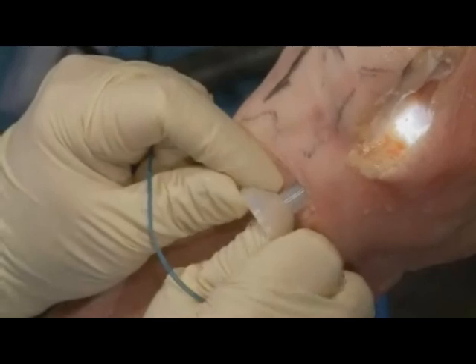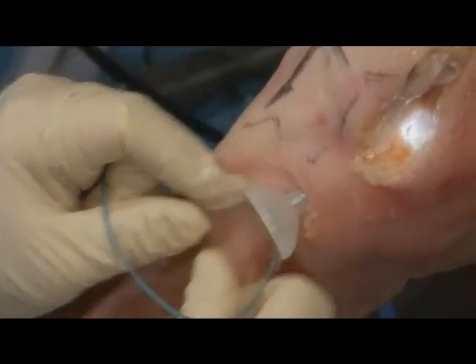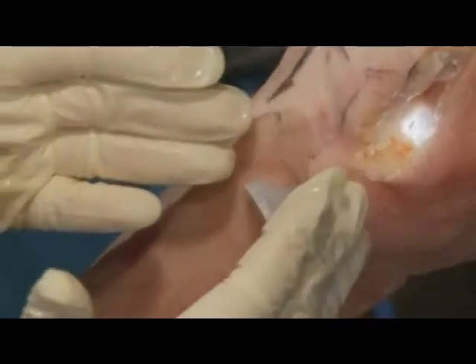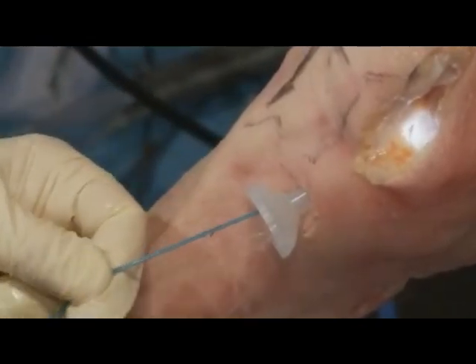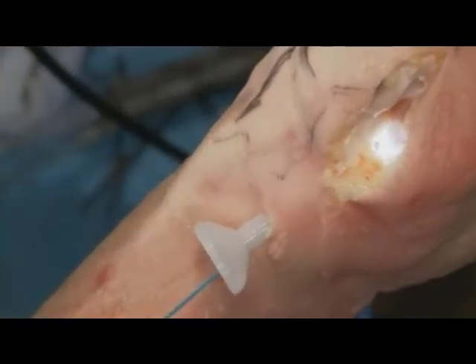You want to cement now? No, I don't want to cement now. I just want to show the technique. So we turn that up the hole, and you see, we have a closed system here. Cement can now only go in the hole, and by pulling traction on the suture, we actually have a pressurized system to cement. Now, let me show you on the inside portion again.